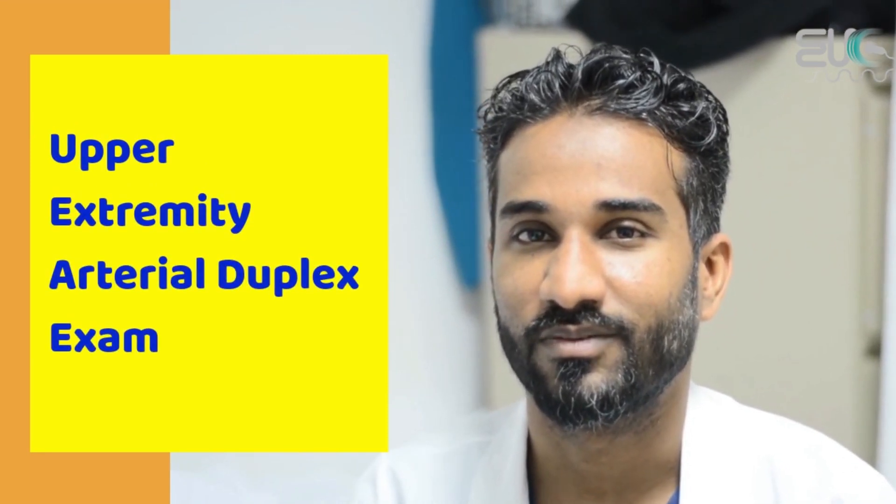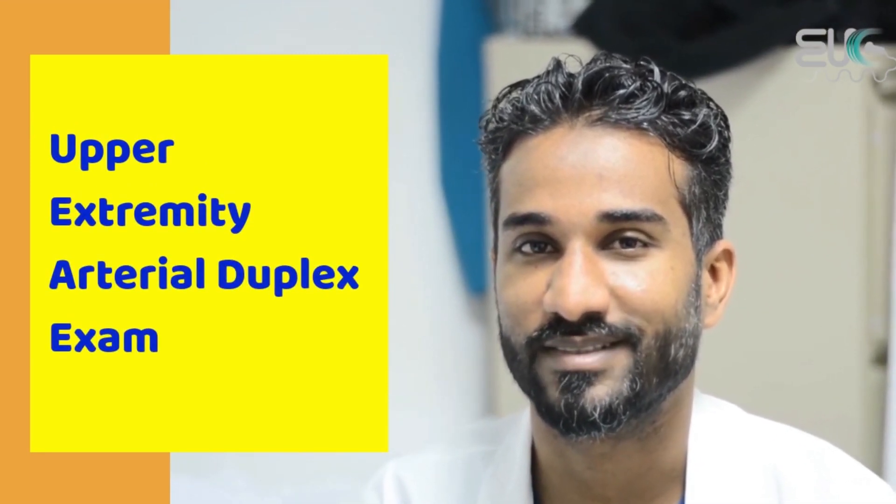Hello, this is me again. Today I will show you how I scan my vision for the Upper Extremity Arterial Duplex study.